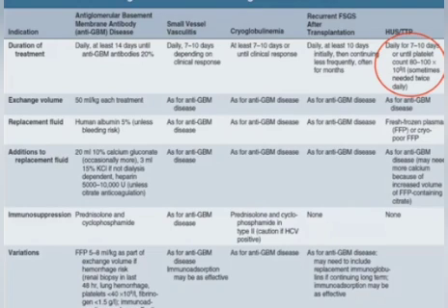The other indications are between 7 to 10, sometimes 14 days. But in HUS and TTP, you have to keep an eye on the platelet count. The limitation here is the platelet count. So if you reach this, you should stop it.